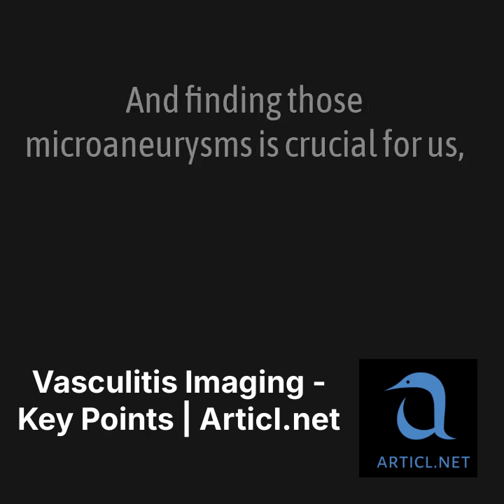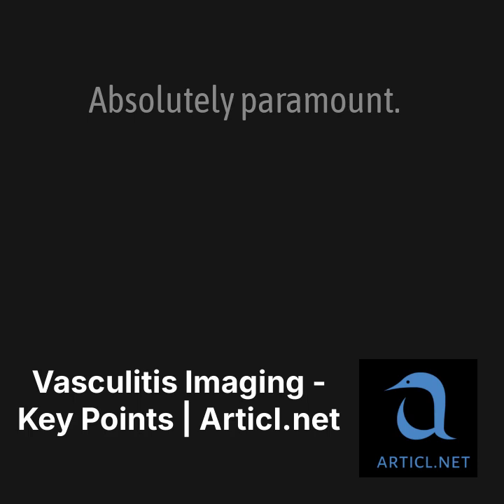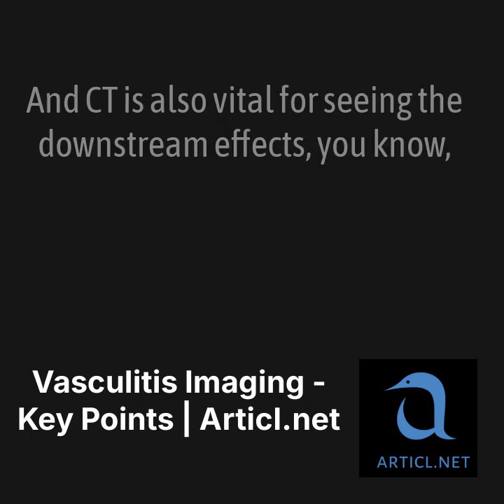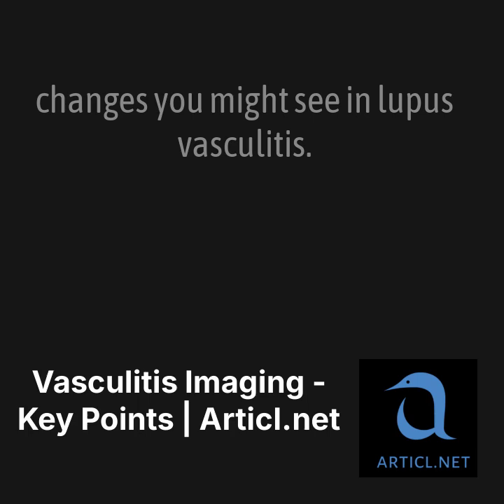And finding those microaneurysms is crucial for us, isn't it? Potential bleeding risk, targets for embolization. Absolutely paramount. And CT is also vital for seeing the downstream effects, like lung nodules in GPA or those significant bowel wall changes you might see in lupus vasculitis.